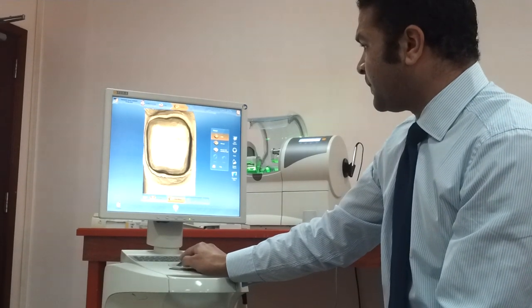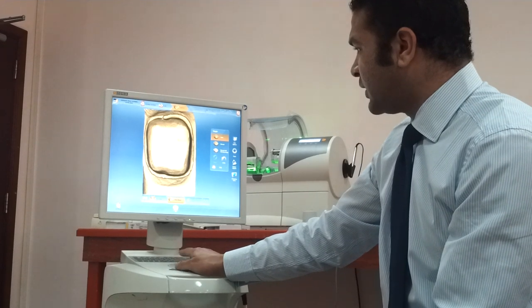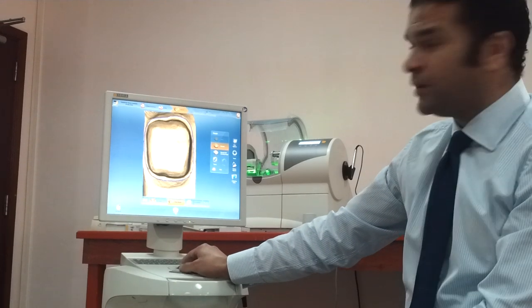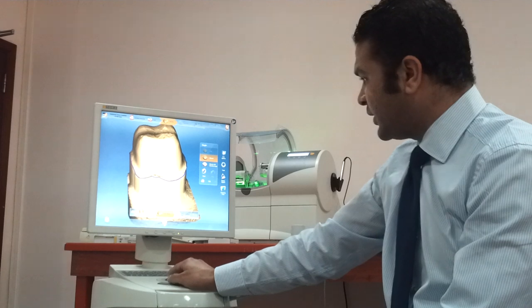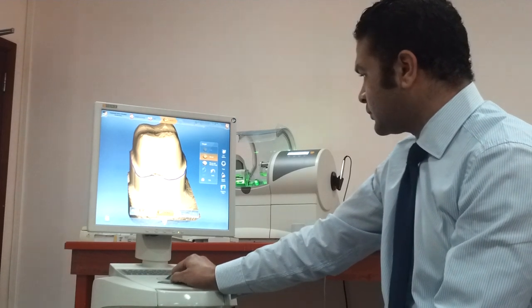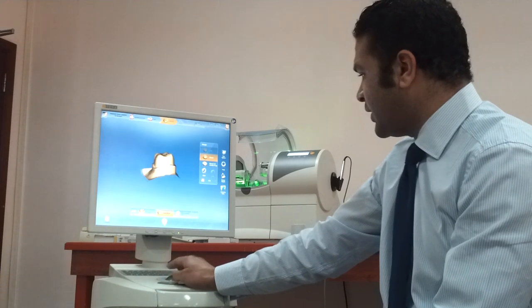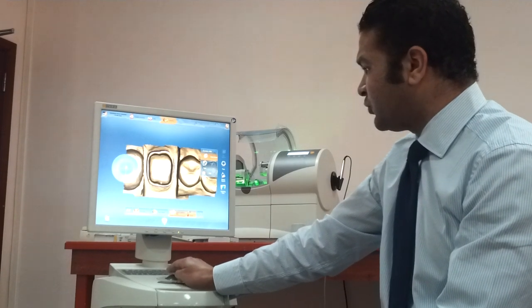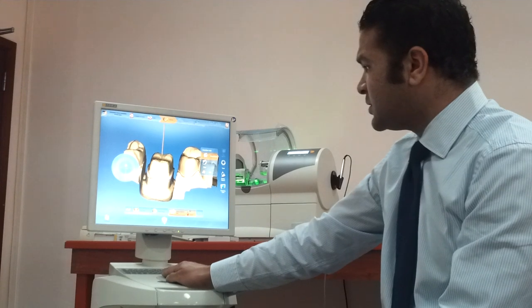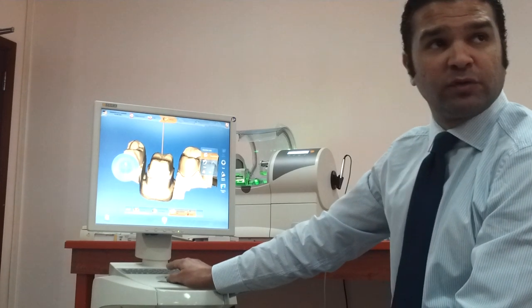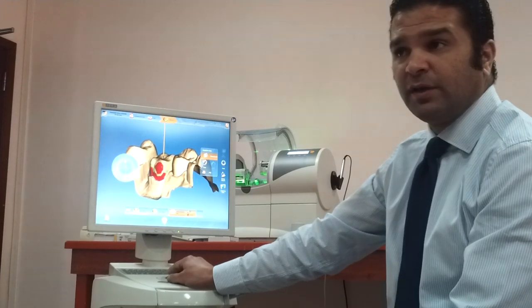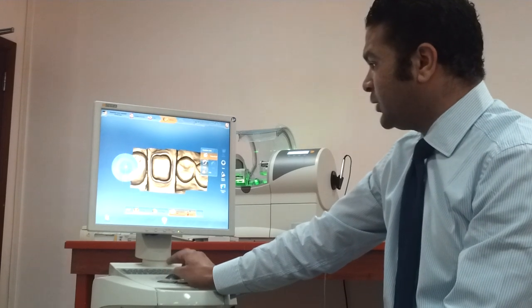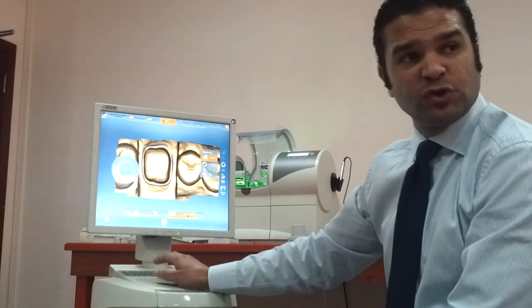I'll draw my margins — double-clicking at the start and end of the finish line. This will be my finish line of my prep; it's a very good prep. Then I'll determine my insertion axis. If there are undercuts, you can modify the insertion axis and the software will alarm you. Our preparation shows no undercuts with a path of insertion parallel to the long axis. I'll press OK and Next.